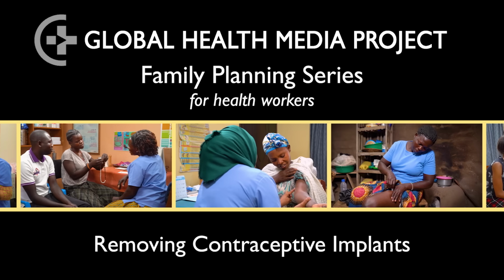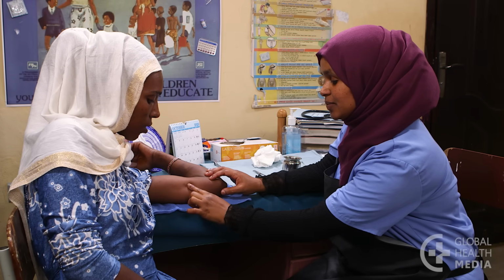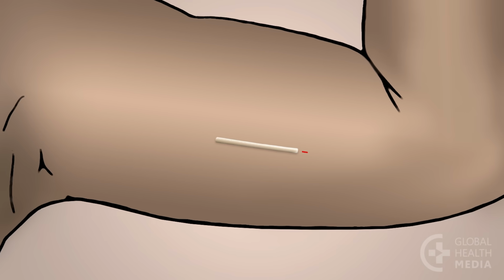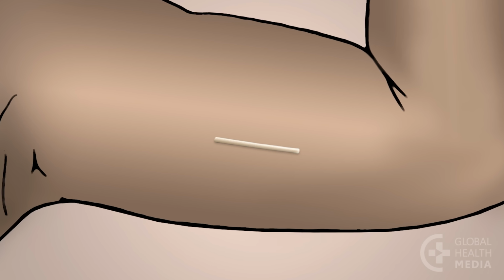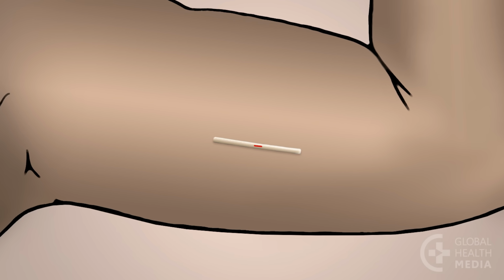Removing contraceptive implants. There are several ways to remove contraceptive implants. This video shows the longitudinal and the perpendicular approaches, as well as the modified U method for rods that are more difficult to remove.